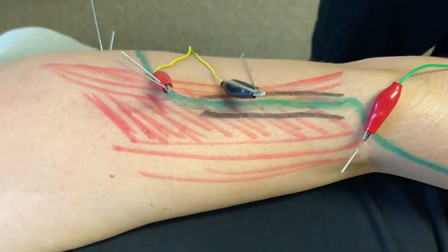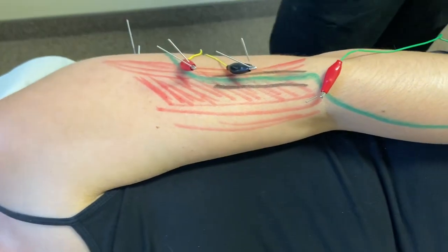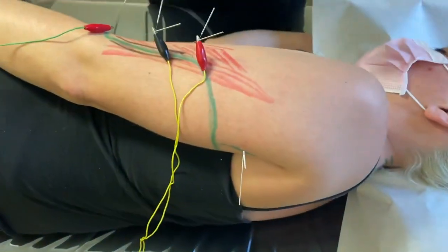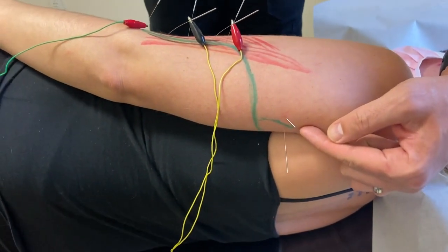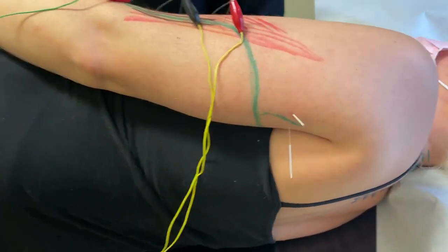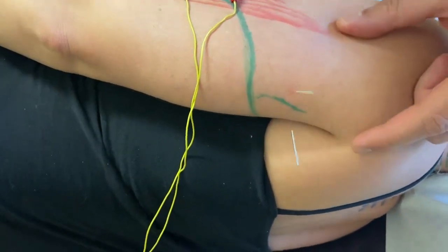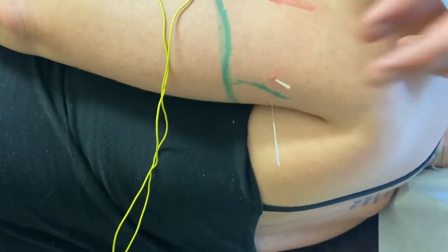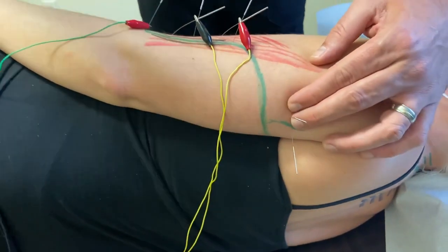Now, I want to show you the back part of the radial nerve when it wraps around the rear of the humerus. And we're going to switch places here. So the best way to do this is we want to neuromodulate back into here. And there's no better way to neuromodulate than to use a motor point. And so what I've done here, this is the motor point here, and one is just to pair it because we use a 2-needle technique here. I just want to show you the stimulation of the motor point.